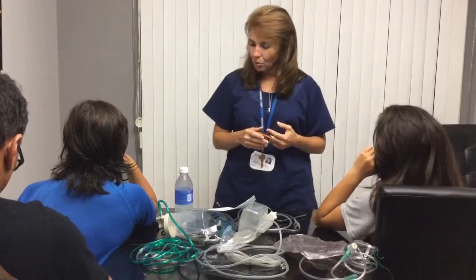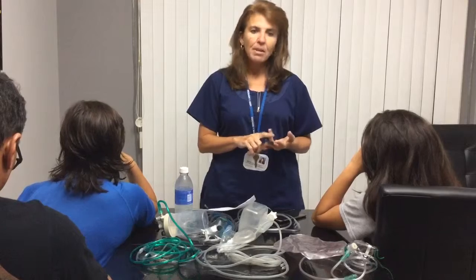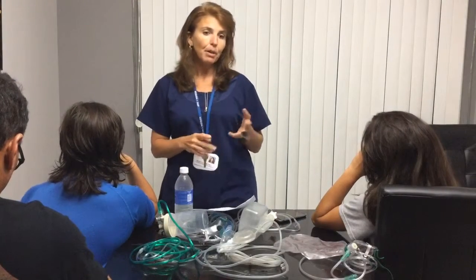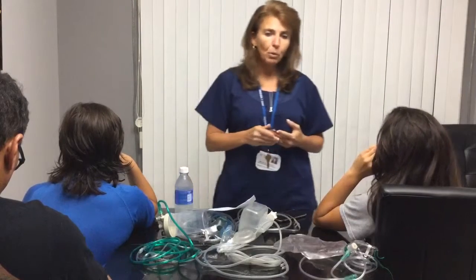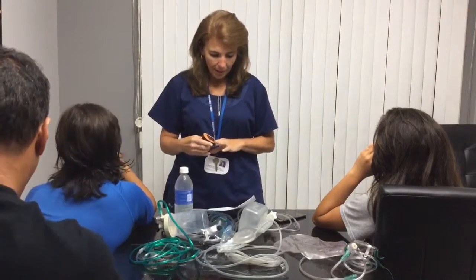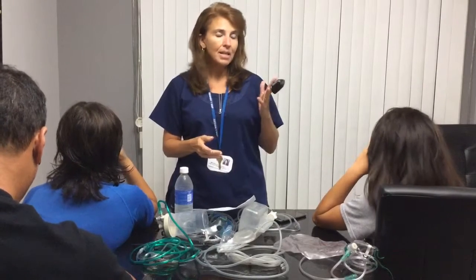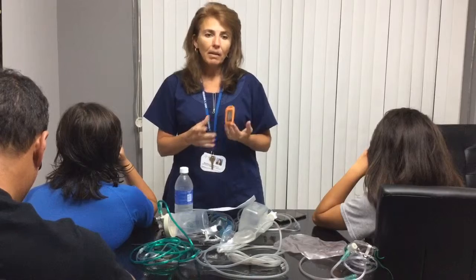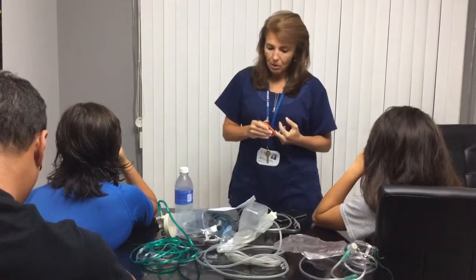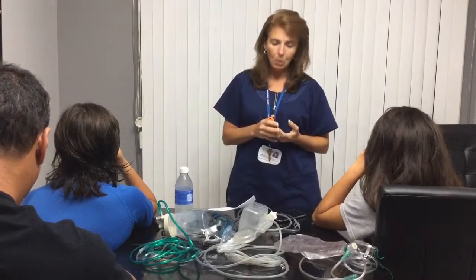You also want to make sure that you avoid hands that are edematous or possibly cold. If the patient has low blood pressure or poor perfusion, you would want to possibly use an earlobe for the reading. Other things that can affect a reading are excessive ambient light, as well as artificial nails and dark nail polish. So you'd want to avoid those areas as well, or make adjustments accordingly.